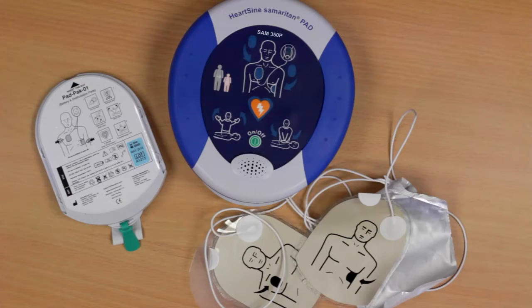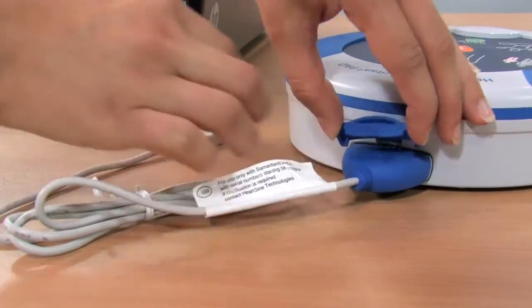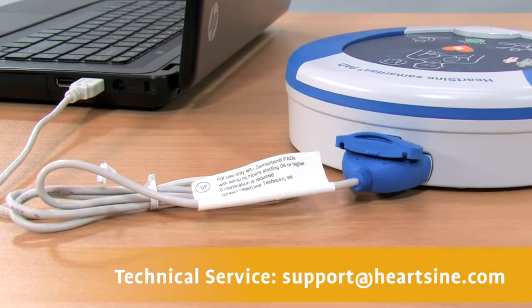The Samaritan PAD stores up to 90 minutes of heart rate information after use. Use the data cable to download the event data for a physician who may want the information from the device to formulate treatment decisions. The data cable is available from your authorized HeartSine channel partner. After downloading the event data, please erase the data from memory. If you need assistance to do this, contact HeartSine Technical Service.